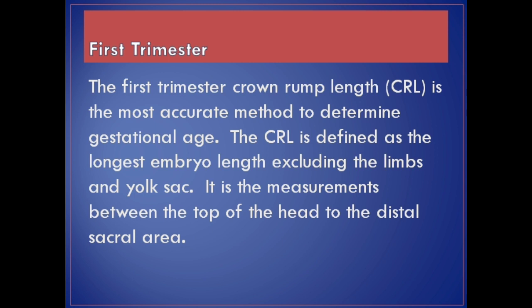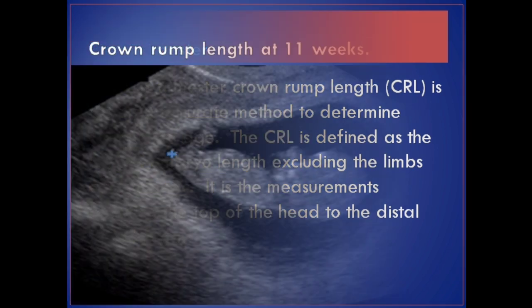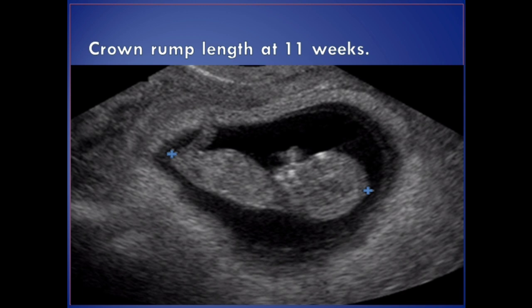First trimester. The first trimester crown rump length, CRL, is the most accurate method to determine gestational age. The CRL is defined as the longest embryo length excluding the limbs and yolk sac. It is the measurement between the top of the head to the distal sacral area. This image shows crown rump length at 11 weeks.